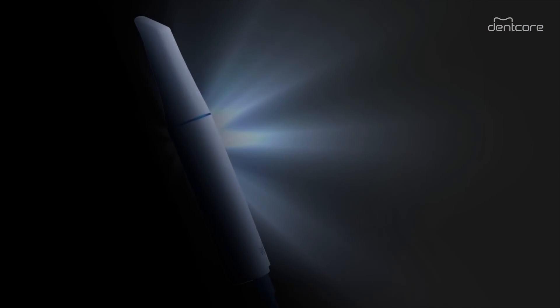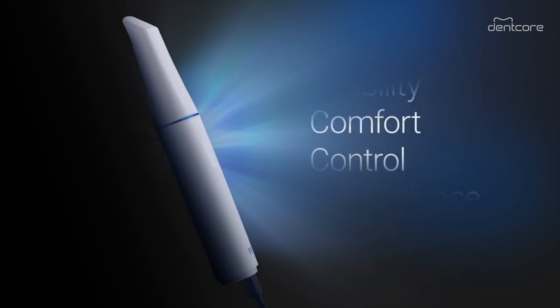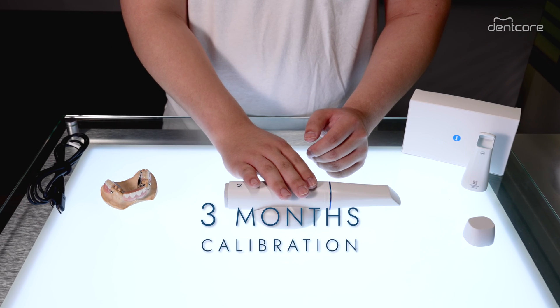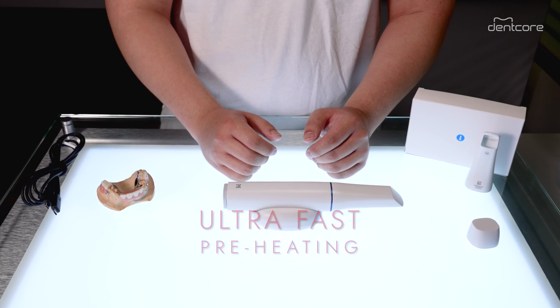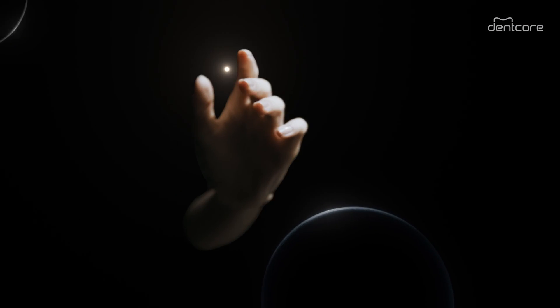Some more improved features with the i900 include the newly designed robust and flexible cable, as you can see here, a three-month calibration cycle, and an ultra-fast preheating system which essentially eliminates the preheating time you had to wait through in the past.